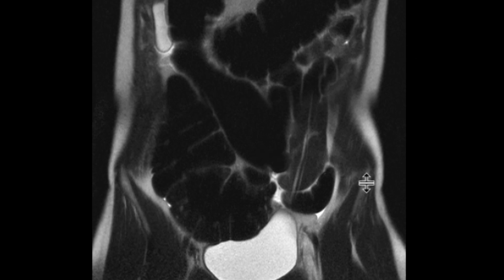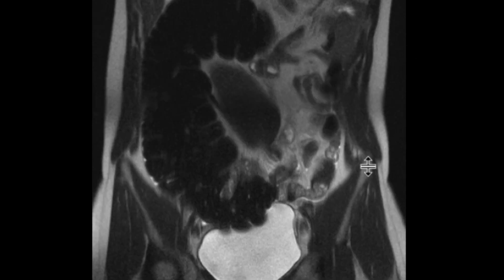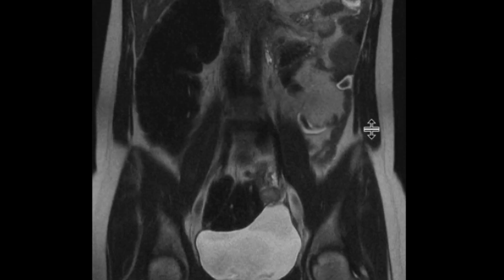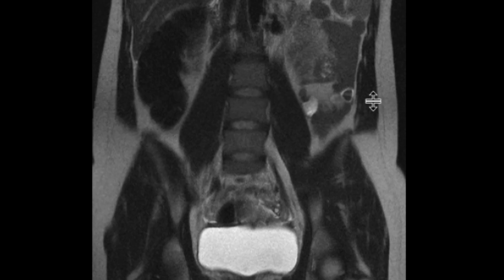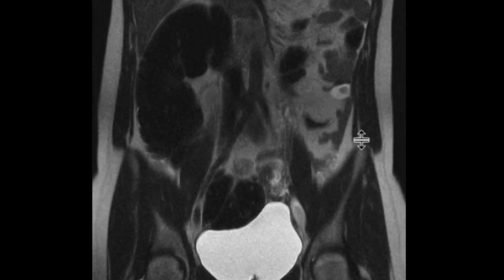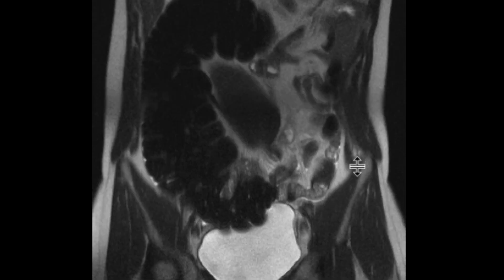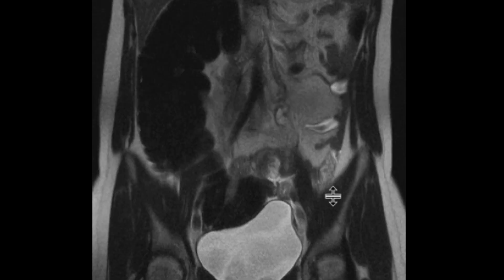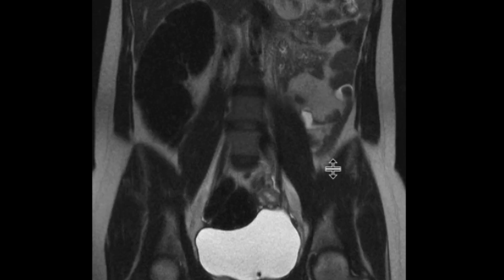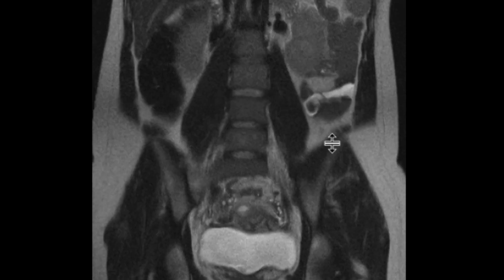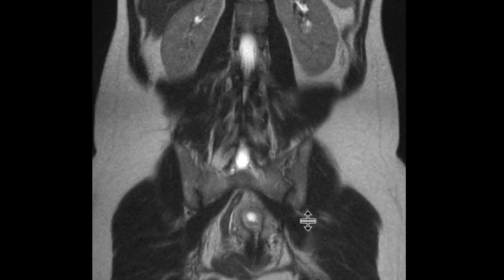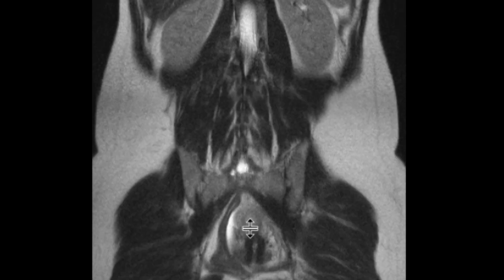Now if we follow the sigmoid colon down a little bit more inferiorly, it is a little bit tough to notice, but there is a little bit of a twist right around this location. It twists around, and as you follow it more inferiorly, notice how small it becomes over there.